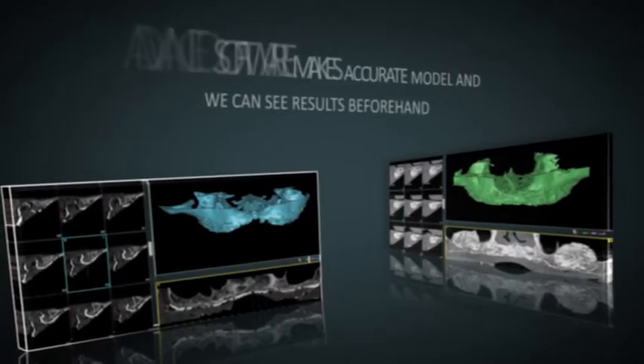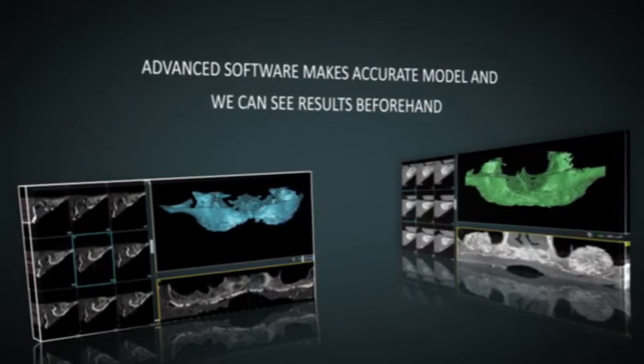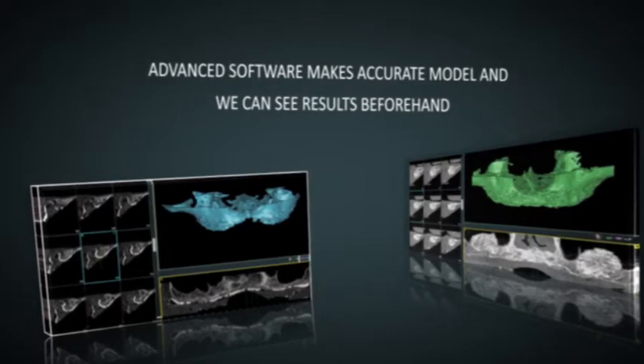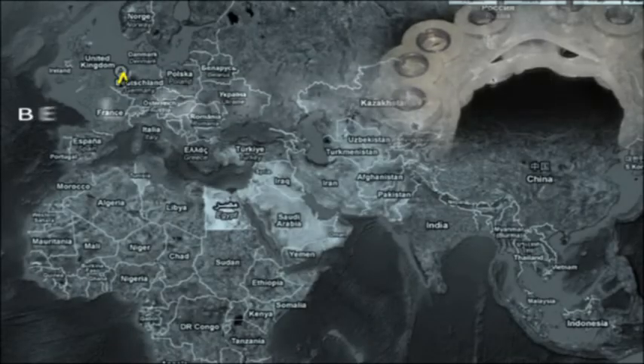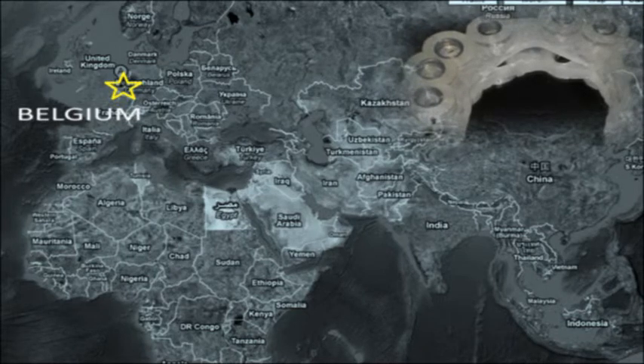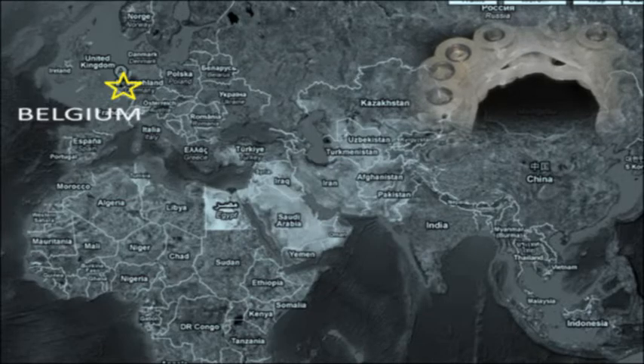A few months after the bone graft, we are now ready for implants. A CT scan of the jaw was done and using a special dental implant planning software, the dental implants were positioned in the most optimal position. The plan is emailed to Materialise in Belgium, where a CT scan surgical guide is made by stereolithography. The guide is then placed over the jaw bone and implants are placed according to plan.